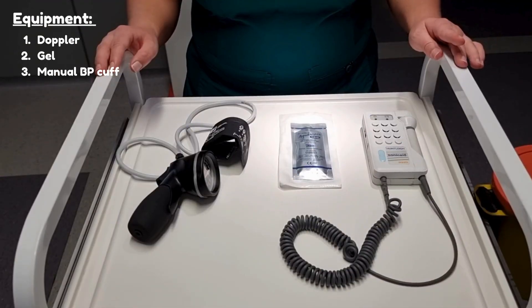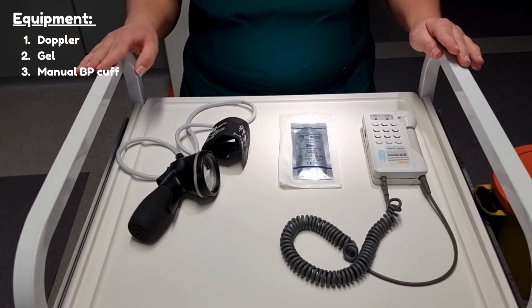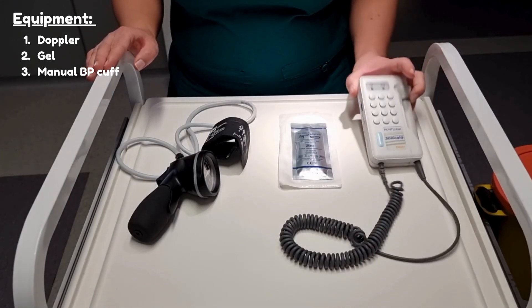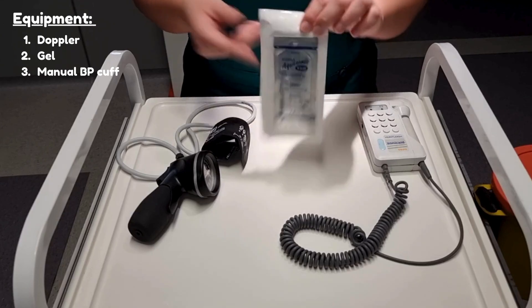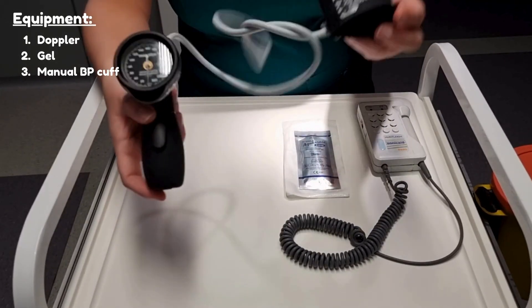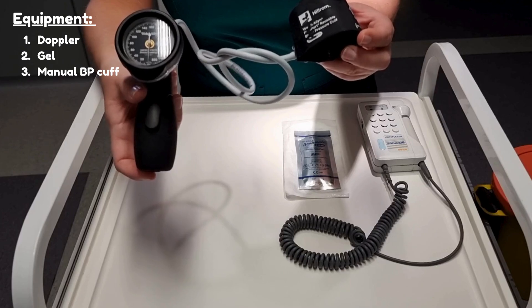So this is all of the equipment that you will need to do a Doppler blood pressure: a Doppler device, some ultrasound jelly, and a manual blood pressure device with an appropriately sized cuff.